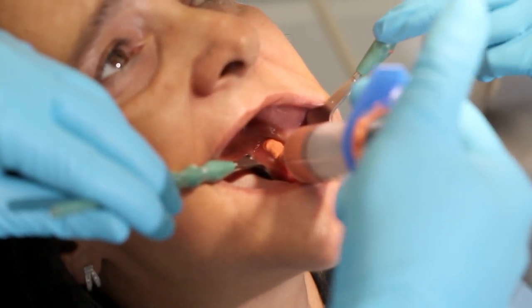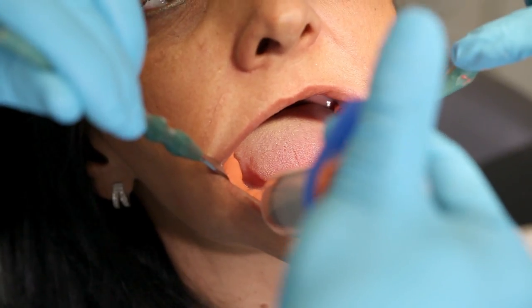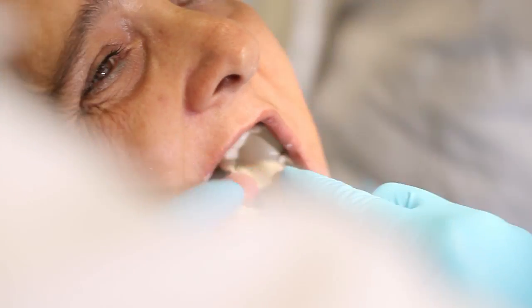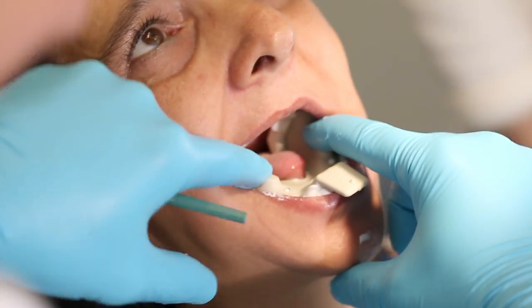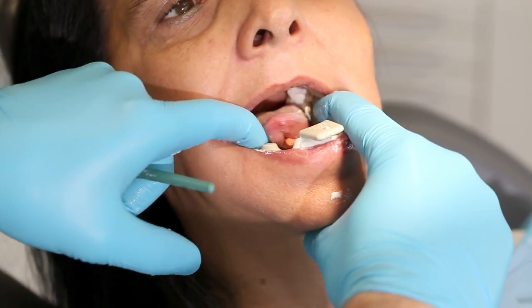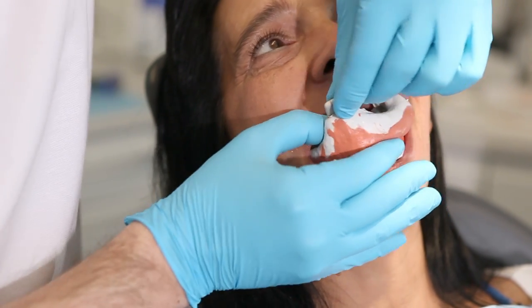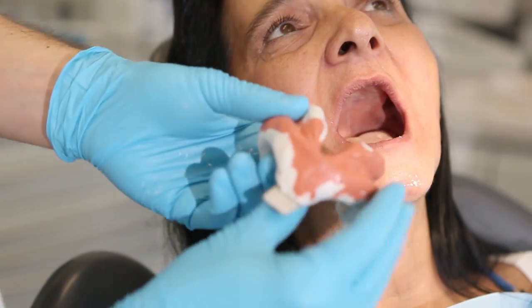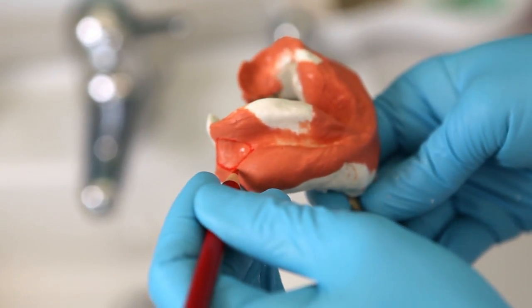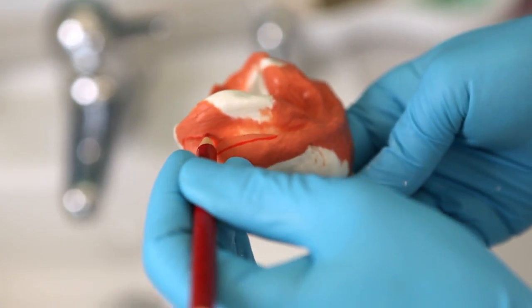The impression of the lower jaw is taken in the same way as that of the upper jaw. Apply the orange material starting in the area of the retromolar pads. Once the tray is in position, ask the patient to push her tongue forward as far as possible and then to move it to the left and to the right. After that, allow the material to set with her mouth slightly closed. The finished impression should be free from air bubbles and all the important anatomical details should be visible.